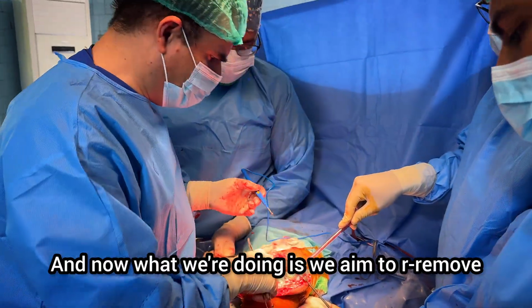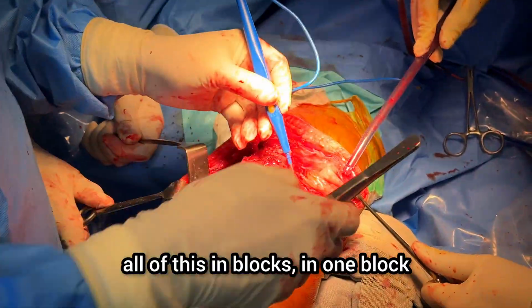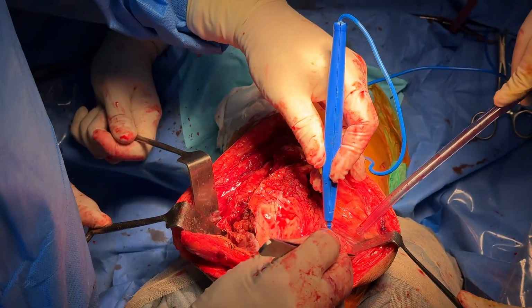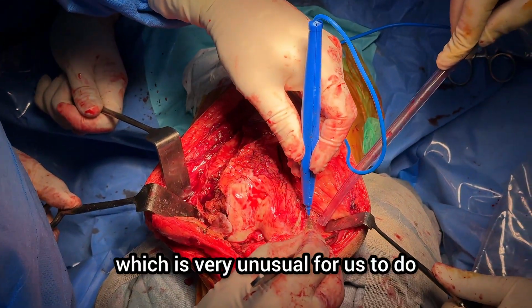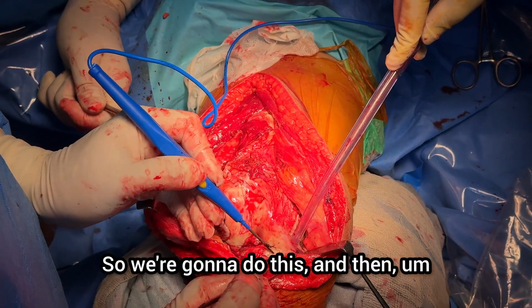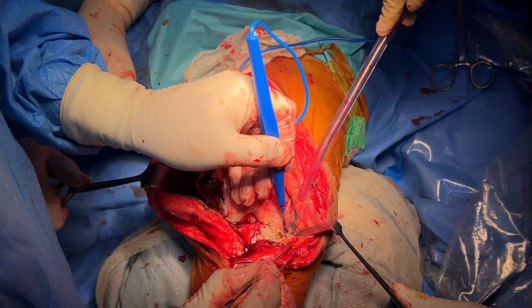Yeah. So now what we're doing is we aim to remove all of this in one block. So I'm getting everything ready, doing the soft tissue dissection, taking the MCL off, as you can see here, which is very unusual for us to do on a normal basis. So we're going to do this, and then we'll try to take this whole femur out smoothly.